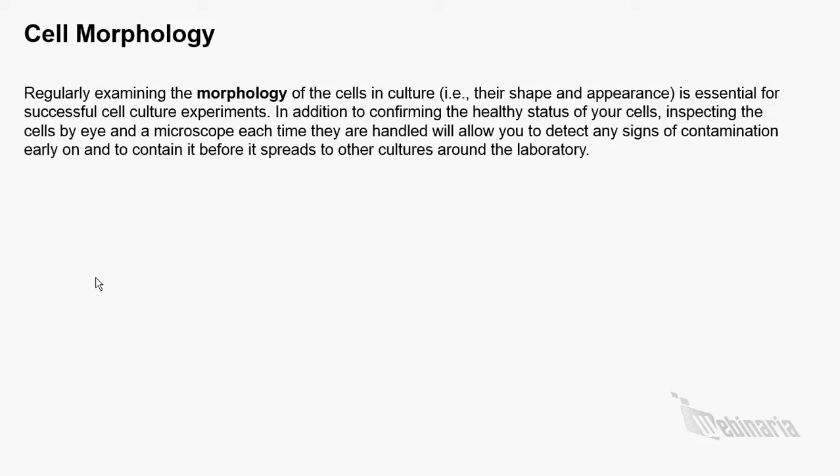Cell morphology. Basically, regular examination is highly recommended, okay? But signs of deterioration of cells include some granulations around the nucleus, also detachment of the cells from the substrate and cytoplasmic vacuolations. These are the basic signs. Okay.